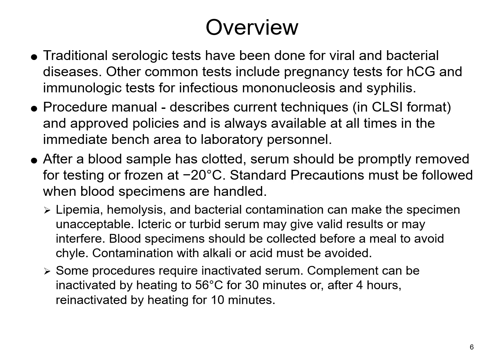Rapid testing is typically used in the laboratory as well as home testing kits. With the advancements of monoclonal antibody testing and technology, this has led to the development of very highly specific and sensitive immunoassays. Some of the common serological and immunological tests include pregnancy tests for the HCG hormone, and tests for infectious mononucleosis as well as syphilis.